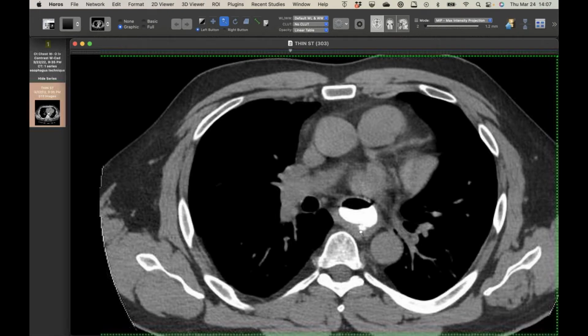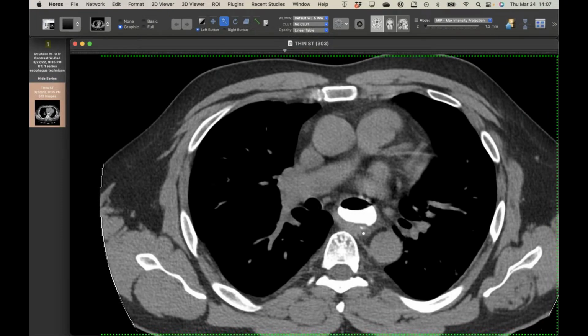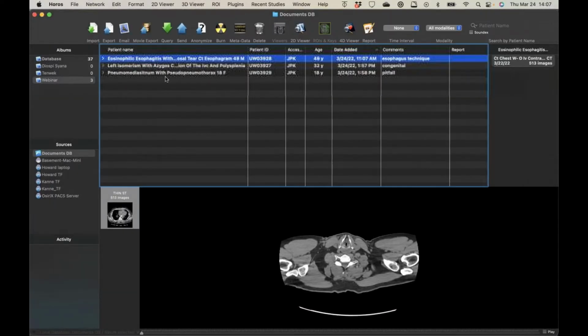It makes it a one-stop shop, because a lot of times if the fluoro is equivocal or positive, they end up getting the CT anyway. So we were able to do these all at once. We do it for a suspected rupture. We have them drink a little bit and scan, then we do a second drink just to make sure. If it's a leak check, we do a non-contrast first, followed by a bolus, and it seems to work pretty well. We modeled it after that paper, I think an AJR several years ago, but there's good literature behind it. It's just a non-contrast chest with a modifier for the contrast in the protocol.